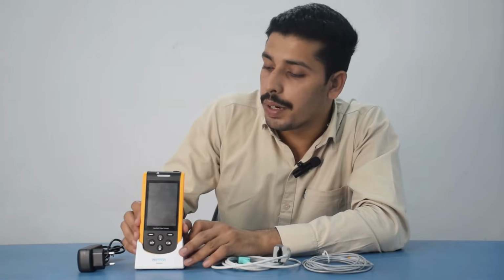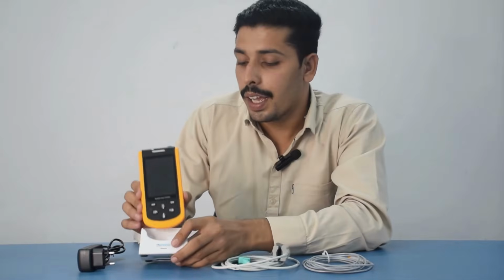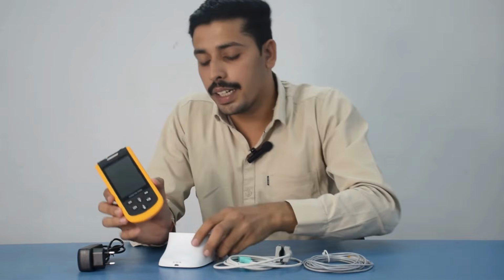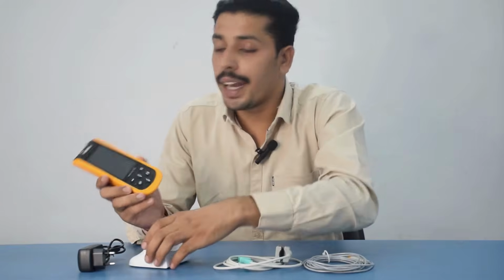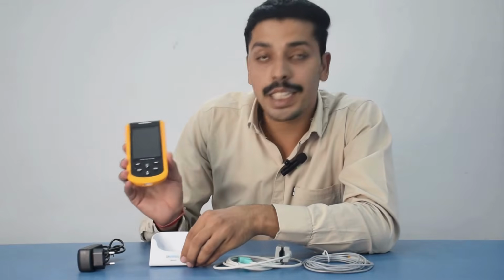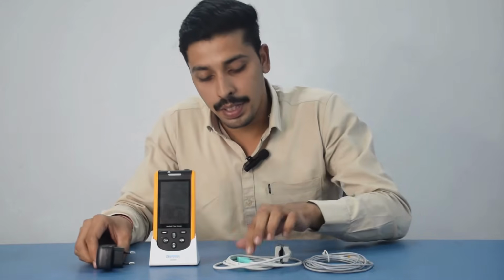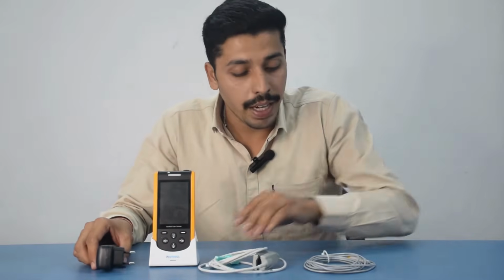So this is our equipment, pulse oximeter. With this equipment, we give a holding charging stand. From the backside, you can see that there is a charging port and it is very handy to use, like a smartphone. With this equipment, we provide one charger, an SpO2 probe and a temperature probe.